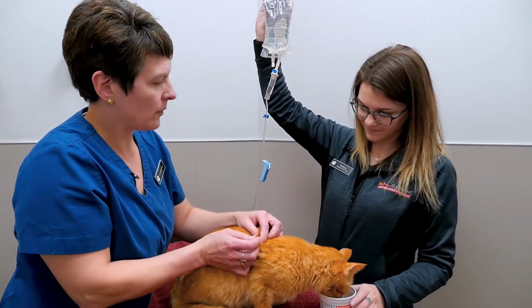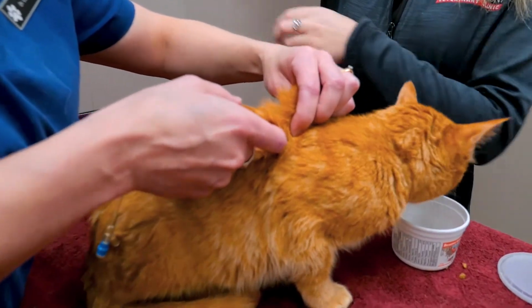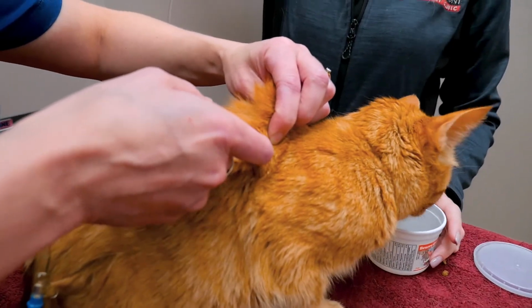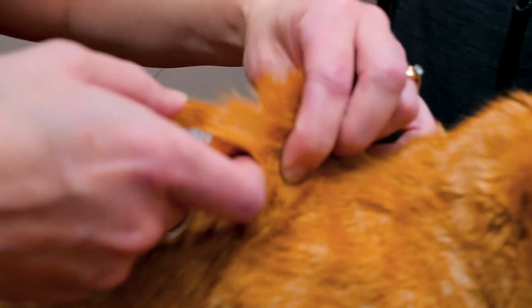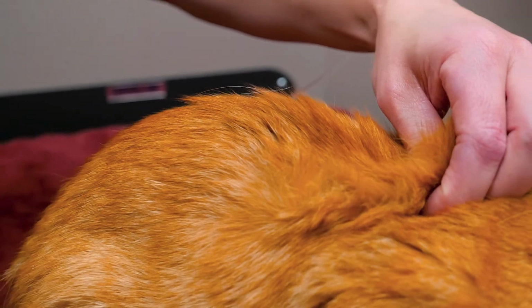Good job, Hobbs. When you're taking the needle out, you just pinch the skin so that you don't get a lot of fluid leaking back out after you've so carefully put that in. So you're just going to pinch right around the needle and then just pull that directly out.